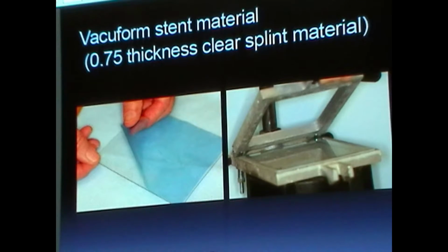We will provide you with vacuum material of the appropriate thickness. I need to verify and make sure we have enough of these. I think we only had 2 in the other building, and I hope we should be able to get 3. The challenge will be with 70 plus of you all, by the time we run 20 of these, the handles on the machine will be hot. I've had 2 students receive second-degree burns on their hands because of that. So this will not be something that we can all do in one setting. It's going to take some time, okay?